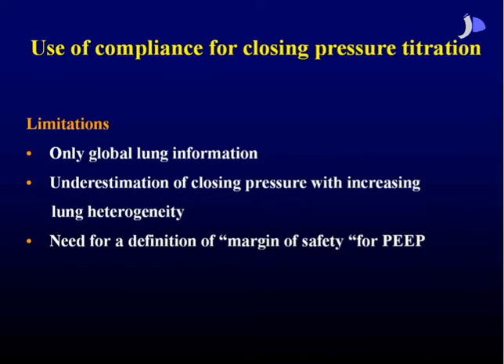What happens in ARDS patients is that some of them are not even recruitable at all. You apply pressure of 60, sometimes you dare to go to 65, and nothing really happens to compliance or oxygenation. So it's maybe wise not to wait until your lung is sick, because I think the major benefit is that this is a real protective lung ventilation strategy.